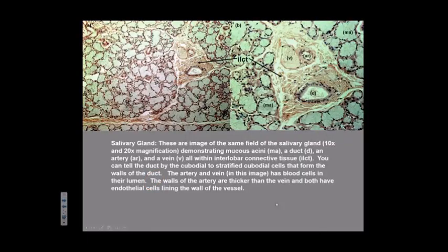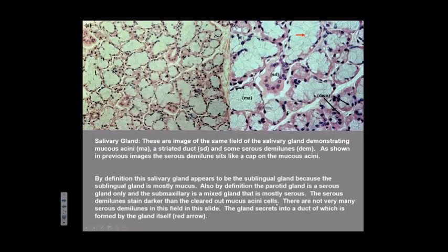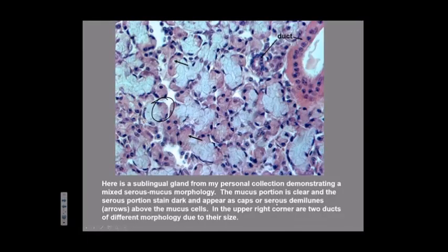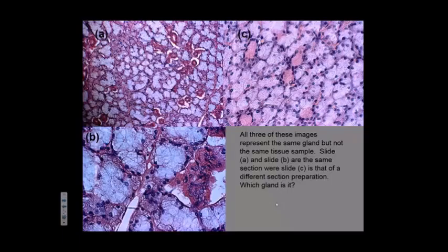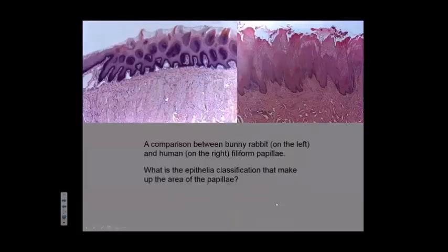So this is sublingual because it's mostly mucus. We get a higher power of it. And there it is. It looks better when the lights are turned off. I'm too lazy. Here is some more. What is this? If it's mostly mucus, it's sublingual. If it's mostly serous, it's submandibular. So I guess it's sublingual. Here's some more sublingual. Here's lower power, higher power, mostly mucus. So it has to be sublingual. Okay. More sublingual. Why? Because it's mostly mucus.